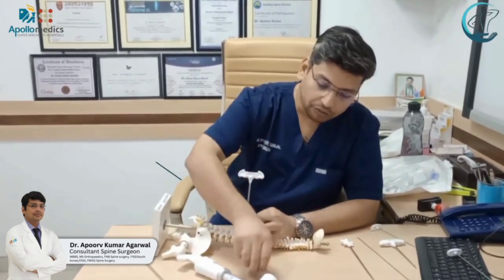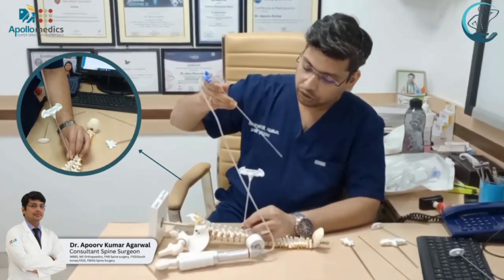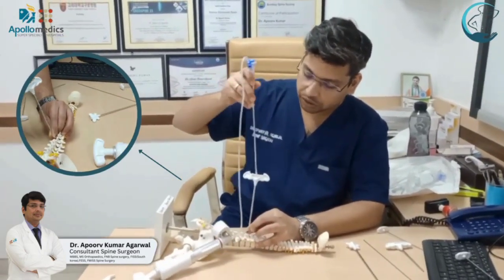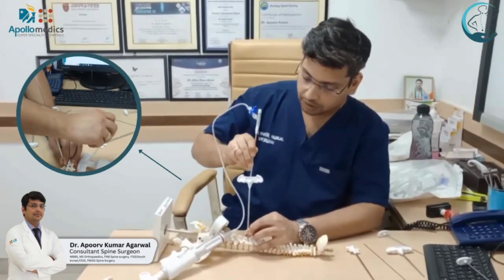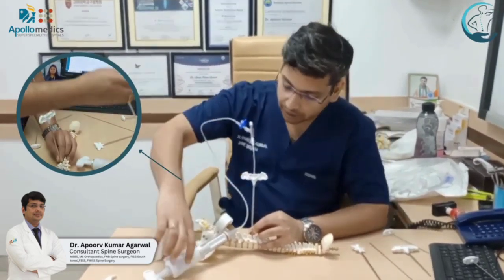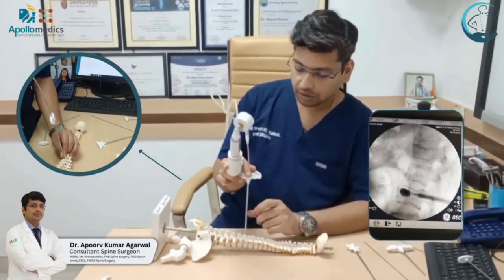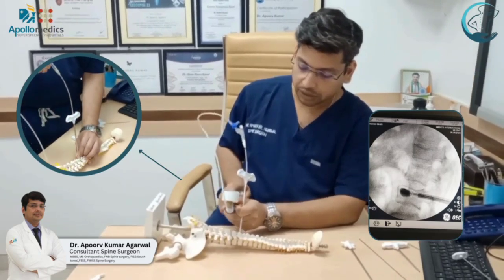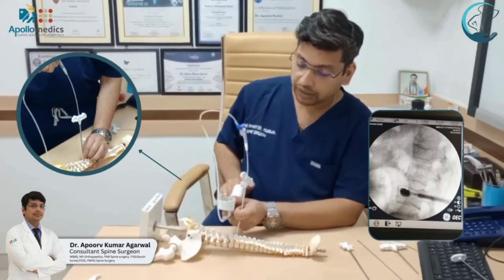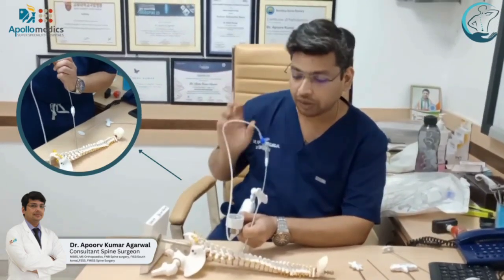Following that, we put these balloon catheters into the body through the working channel. Once inside, we inflate these balloons with the help of kyphoplasty pumps. We inflate under C-arm guidance to confirm that the vertebral body end plates have been elevated through this process.